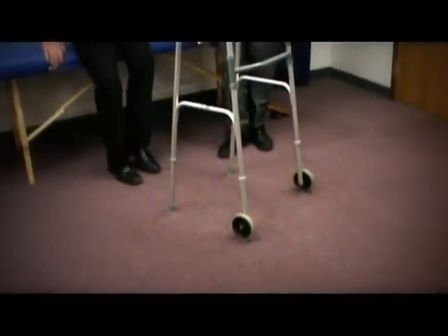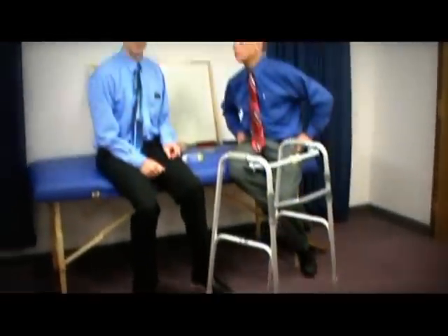So that's a helpful hint. That's one of those little things that makes a big difference. You've got a couple thousand dollars in your new floor, and then you go sliding across it with your walker and put scratches on there. By the way, those skis cost about $25. You can get them cheaper, but if you go to a local pharmacy, you're going to spend $20 to $25 on it. You're going to have to go online to get them cheaper.